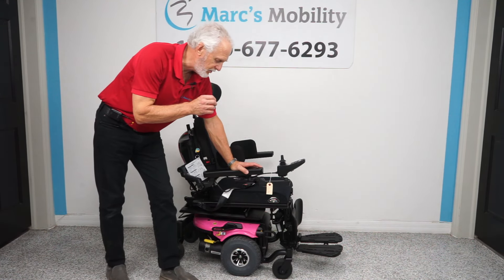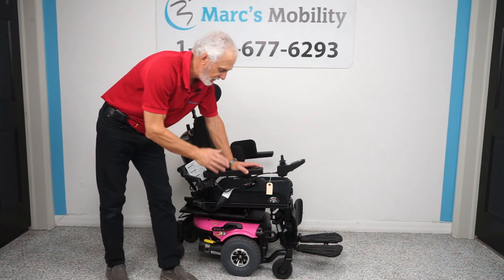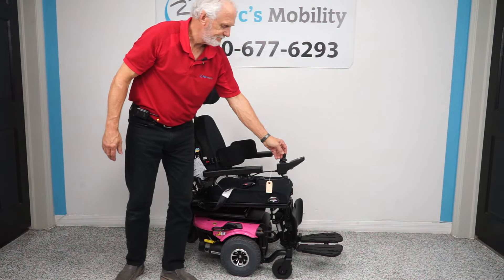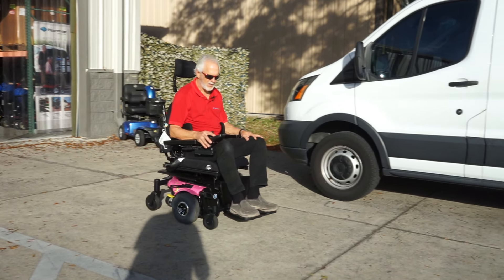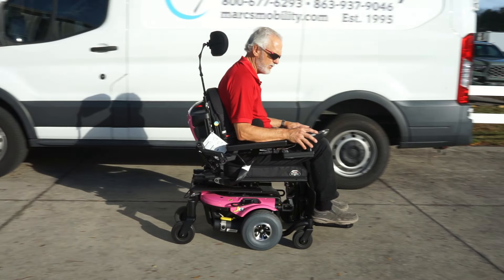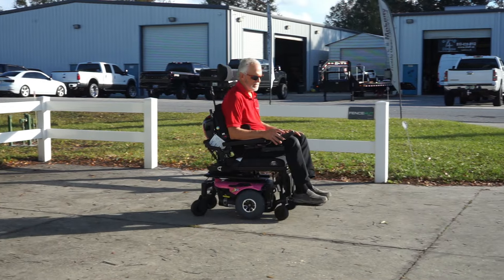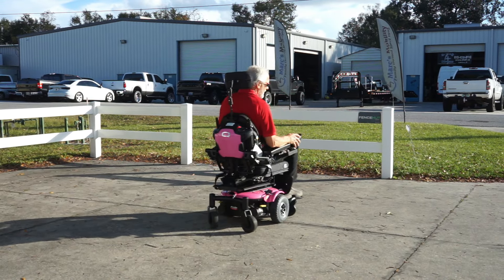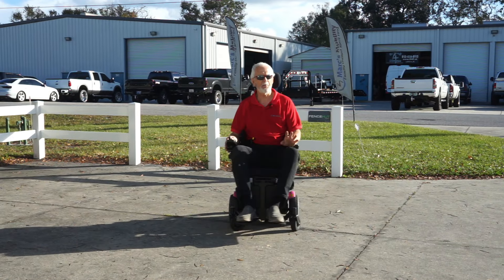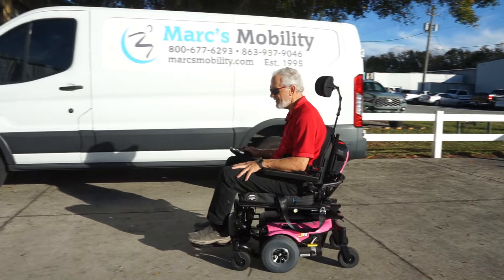If you're looking for a really nice power chair and you just need tilt and leg elevation, you may want to look at this one. It's only been used about three months. This is the J6 power chair, pink in color. It has electric tilt and electric legs — no recline, electric tilt and electric leg. Very smooth, very easy to drive.